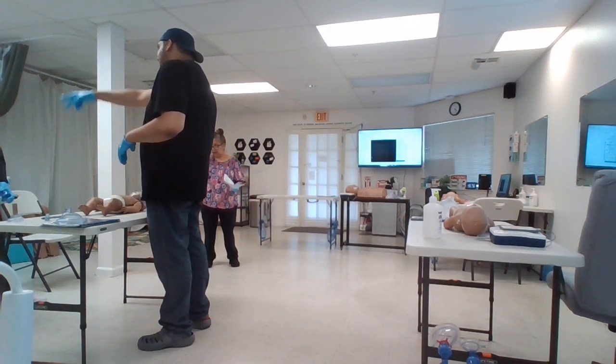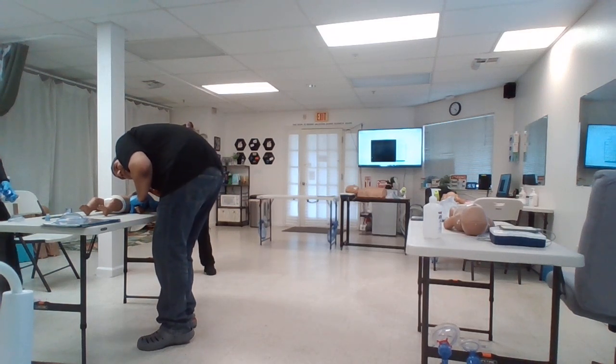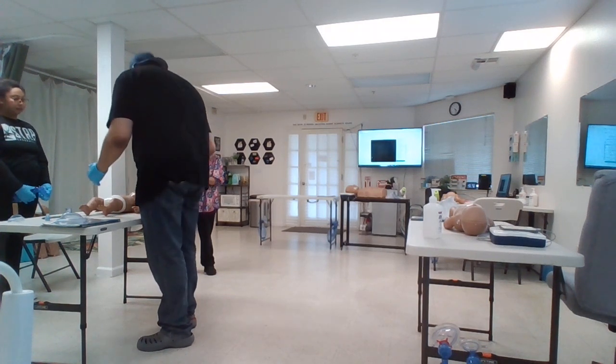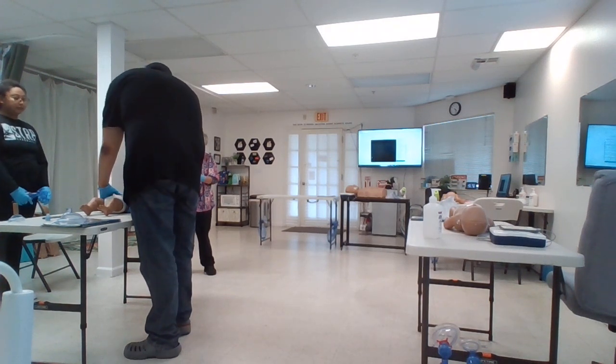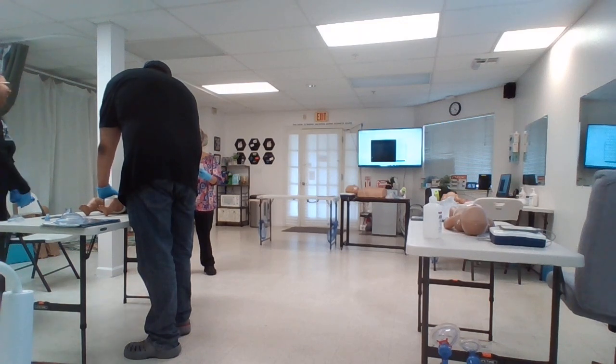Casey, call 911. Get the AED and bring it back. Okay. 1, 2, 3, 4, 5, 6, 7. No pulse. No pulse, no breathing. CPR. 1, 2, 3, 4, 5, 6, 7, 8, 9, 10, 11, 12, 13, 14.